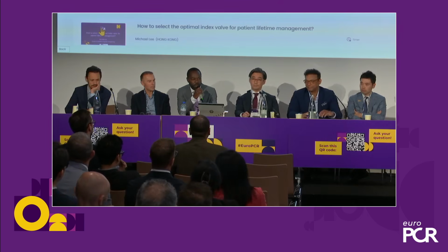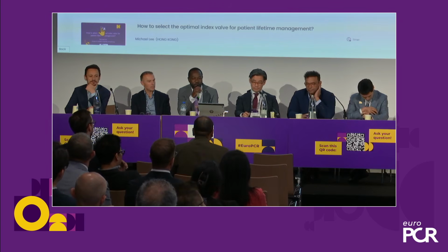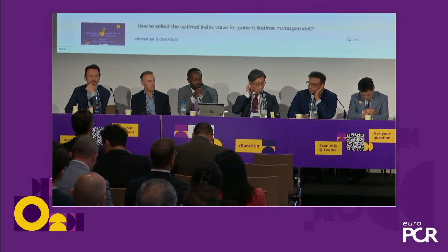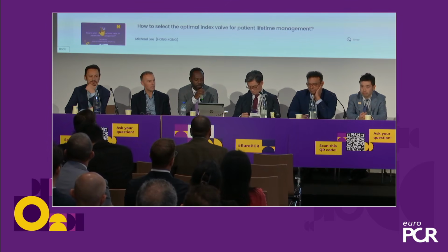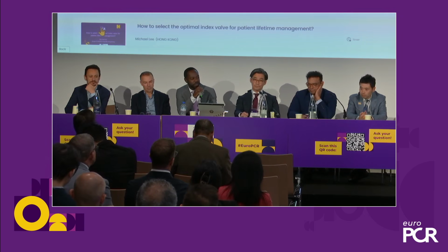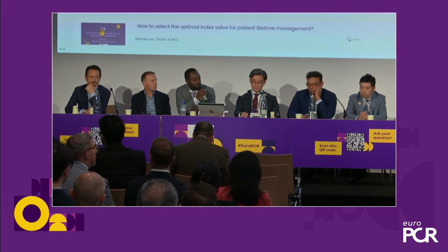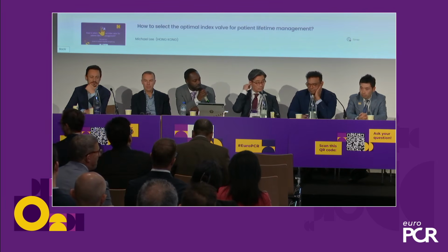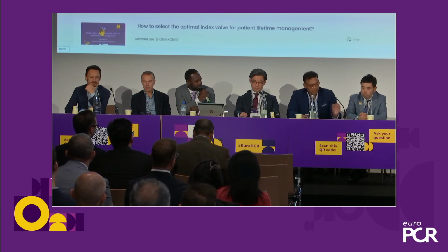Thank you. And Sharad, we regularly talk about lifetime management of our patients, and we understand the importance of the index procedure just to keep the door open for a redo procedure. But sometimes we have to make trade-offs and sacrifice some potential benefits. If you had to prioritize the main goals for a young, low-risk patient, you do a TAVI procedure thinking about a redo in the future, what is your main consideration?